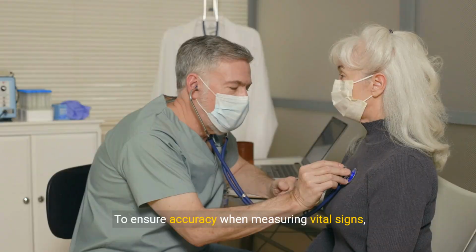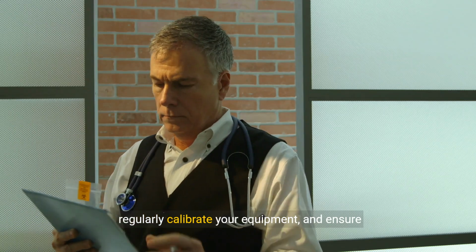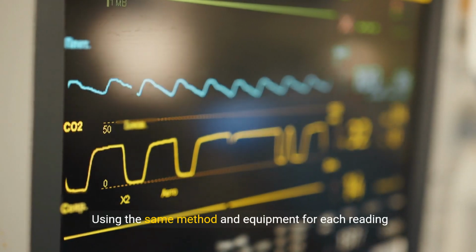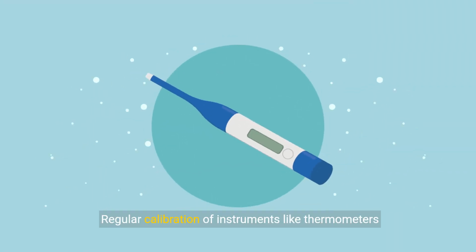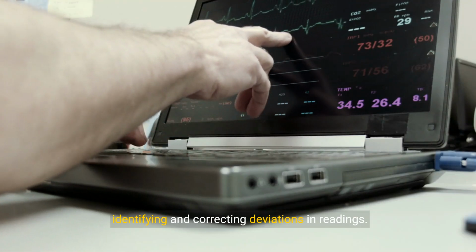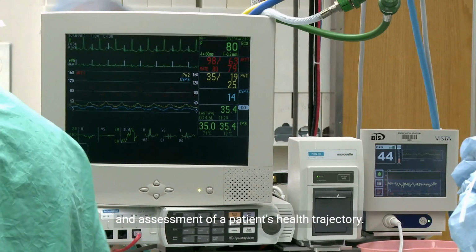To ensure accuracy when measuring vital signs, follow these best practices: maintain consistency in your methods, regularly calibrate your equipment, and ensure proper documentation of each reading. Using the same method and equipment for each reading helps avoid discrepancies. Regular calibration of instruments like thermometers and sphygmomanometers ensures their accuracy, identifying and correcting deviations in readings. Accurate documentation enables effective monitoring and assessment of a patient's health trajectory.